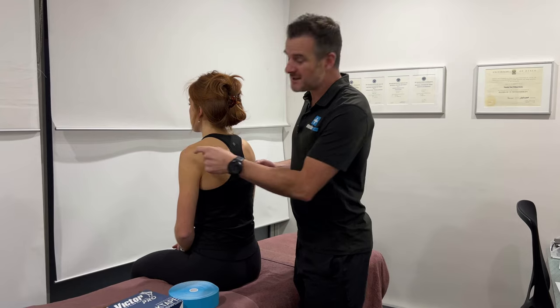I use this for things like subacromial bursitis, rotator cuff tears, AC joint problems, and anyone that just needs some weight out of their shoulder if they've got some sort of injury. So let's look at that in full detail.